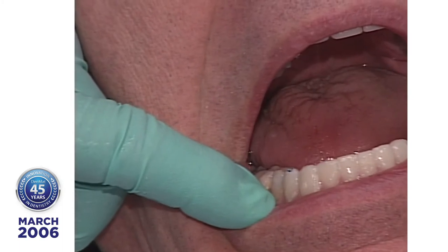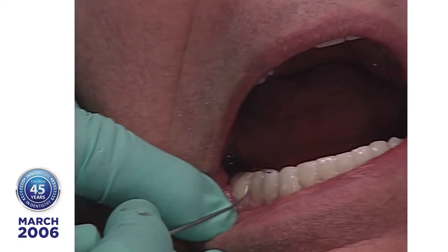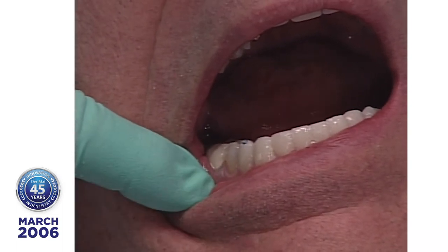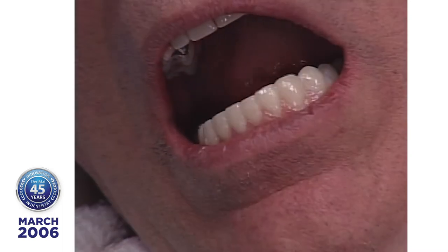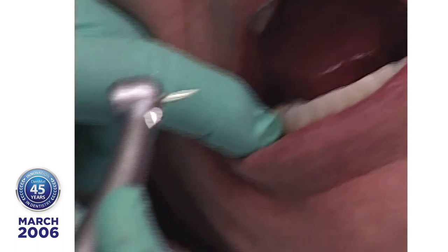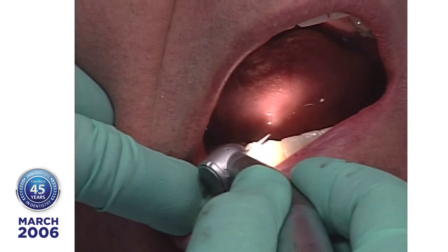We got a heavy spot right here on this lower right first bicuspid. And this one has the lumineer on it, and this one doesn't. So they look pretty close to a natural color. And I'm going to take the finishing diamond here, and we want to get these so they occlude harmoniously. Occlusion is a very important part of this.